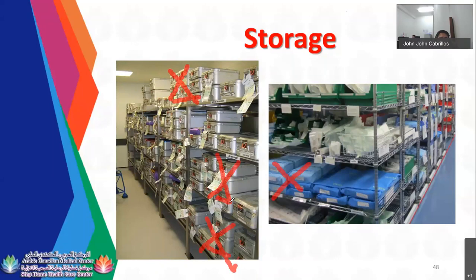For this one, you are not allowed because it can damage the pouches. The pressure is on the bottom part of the packages and it can damage the pouches.